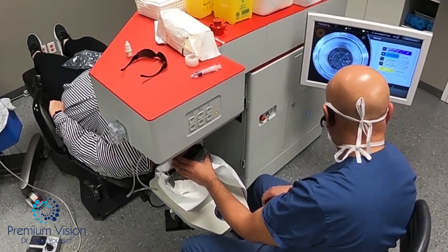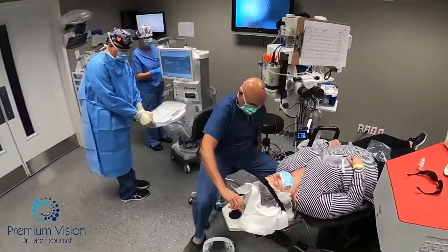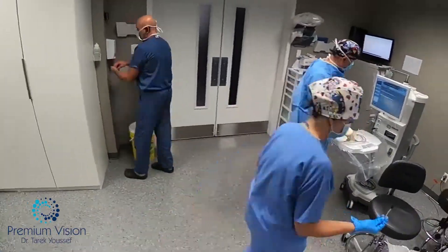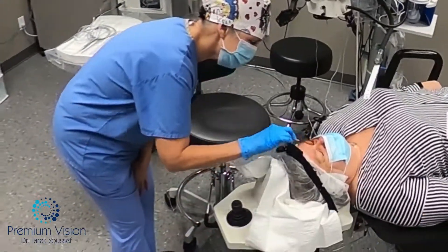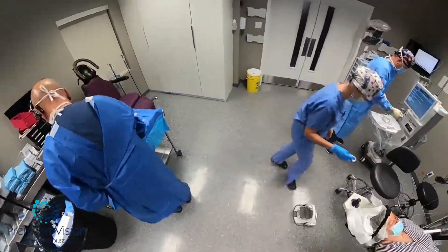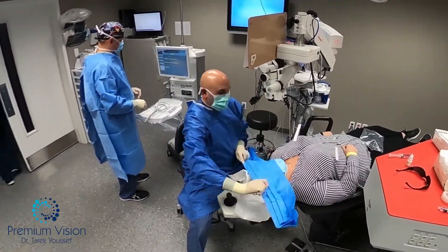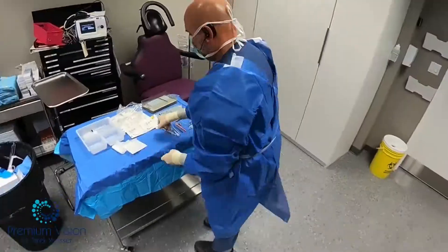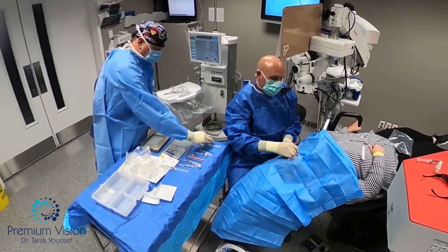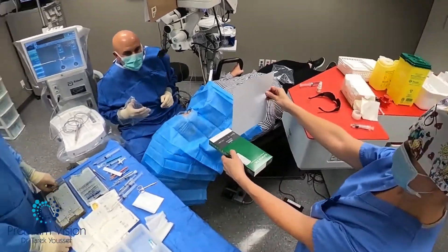Laser going through. The laser is done. Going down, flicking out, going up with the bed, adjusting the microscope, start the surgery. Scrubbing the skin. Opening the drapes, putting the speculum. Previewing the lens, now the white-to-white with the LenStar.